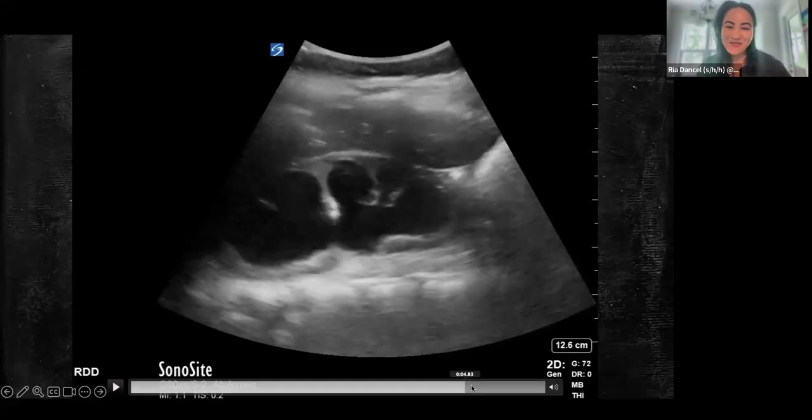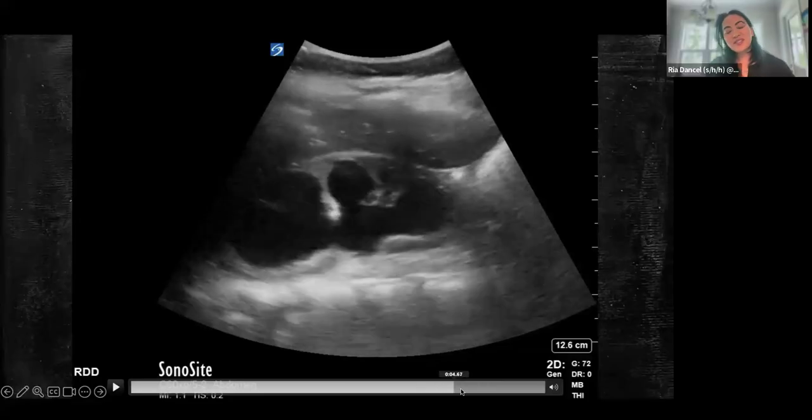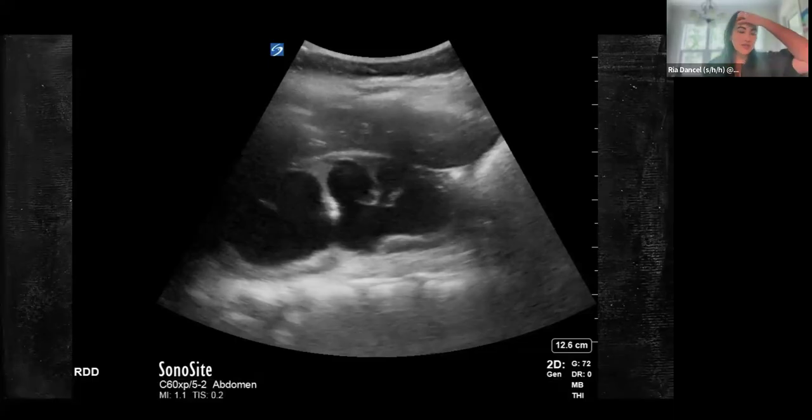Yeah, that was sort of your hydronephrosis. Pretty severe hydronephrosis. You can't really see much of a cortex happening, and that is the difference between severe hydronephrosis versus all of the other stages of hydronephrosis, whether the cortex is starting to be effaced. So this is pretty bad. This is on the right side of the body. And if you think about it, there was a ureter that was sort of struggling on the right side of that transverse bladder. But let's take a look at the left kidney.